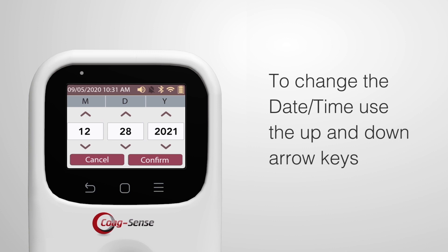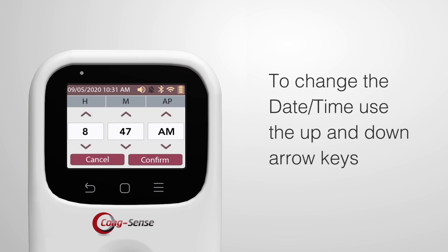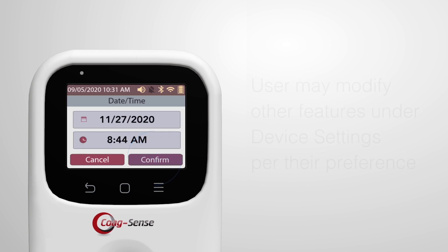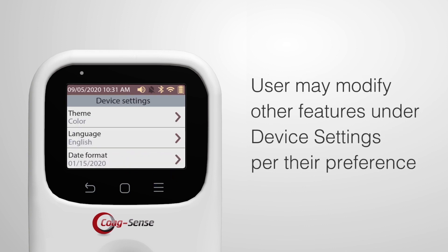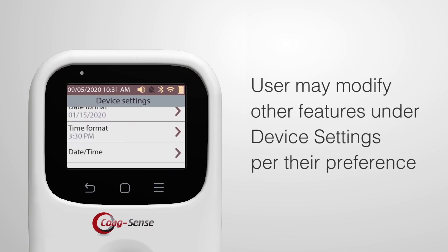To change the date or time, use the up and down arrow keys to get the appropriate month, day, year, or hour, minutes, AM, or PM, then confirm. Users may modify other features under device settings per their preference.